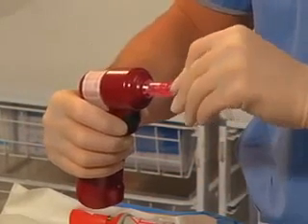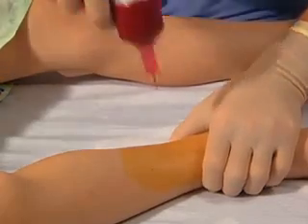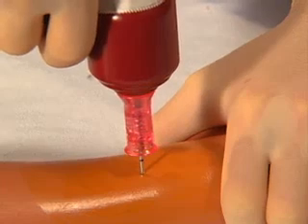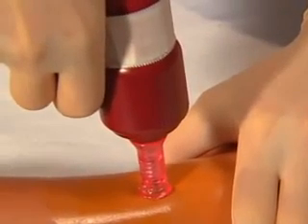Turn the safety cap clockwise to remove it. Pull it off the needle. Place the needle against the skin overlying the site, 1 to 2 centimeters from the adjacent physis. Apply gentle, steady pressure while engaging the trigger to allow the needle to penetrate the soft tissue and then the bony cortex.